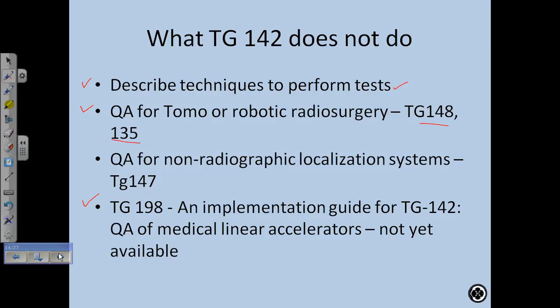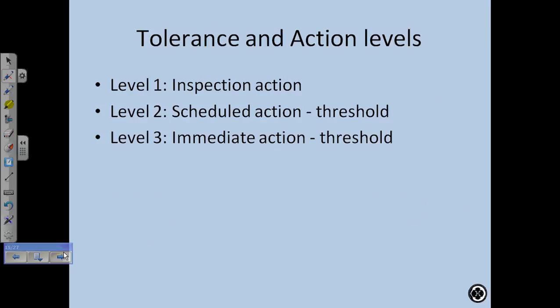Okay, so anyway, there's an implementation guide that you should know is coming out. So those are some things it doesn't do. Tolerance and action levels. This is something else that's covered. I really like this part. This is something else that's covered in TG142.